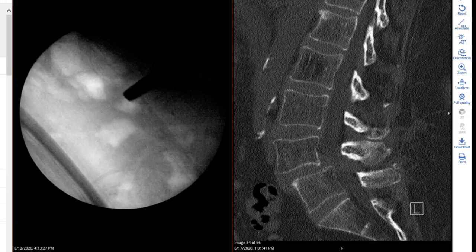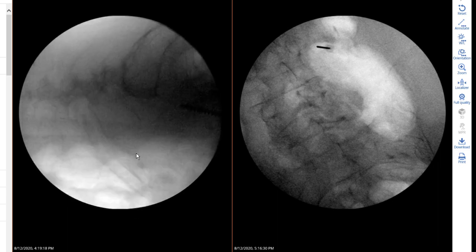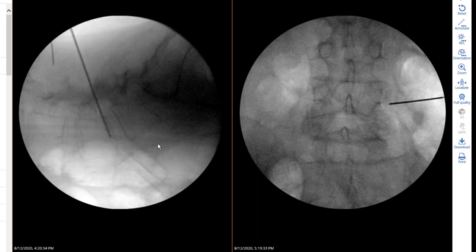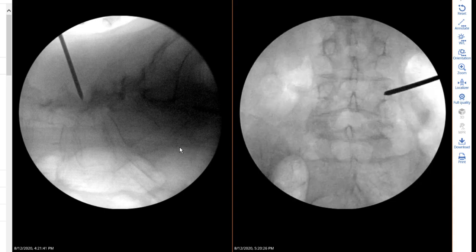Now I am going to show you the operative pictures, and I want you to pay attention to the time we started the surgery, which is 4:13. The time shown is wintertime, so practically around 4:20-4:30 we started the surgery. Here we go with the localization, I'm doing the midline marking, my trajectory of the disc marking at L4-5, and I put my marking on the skin to mark the trajectory of the disc.